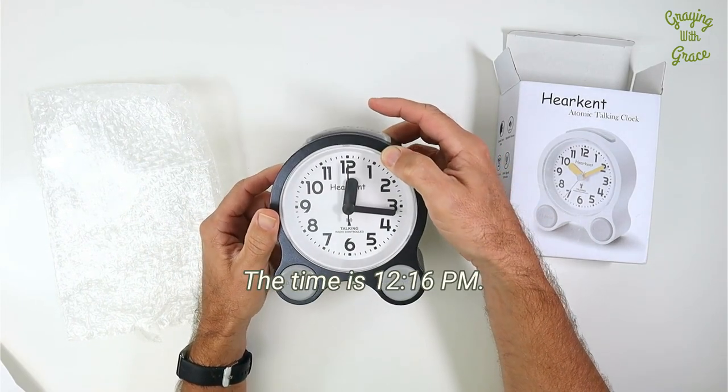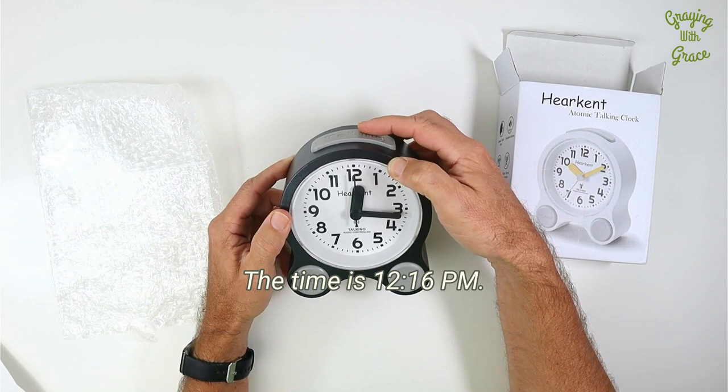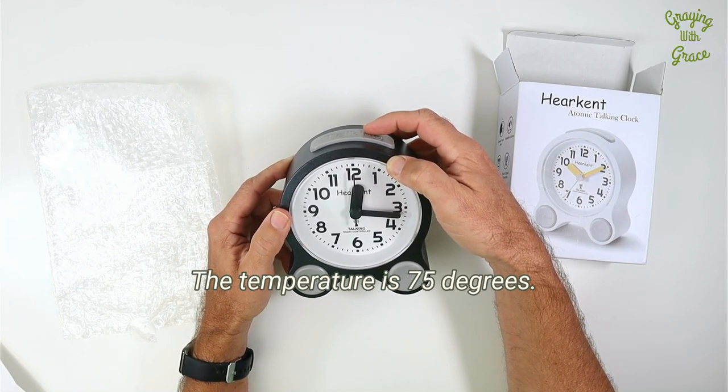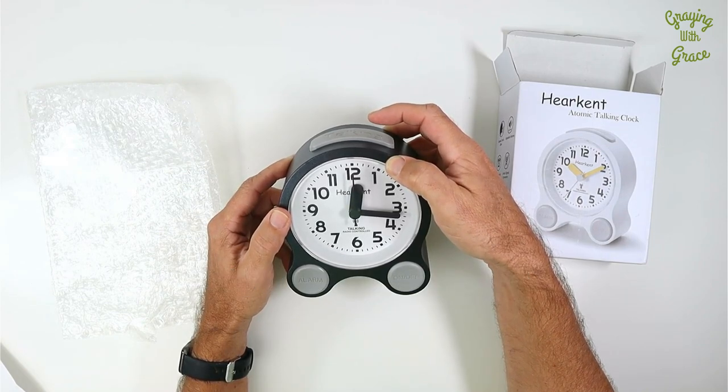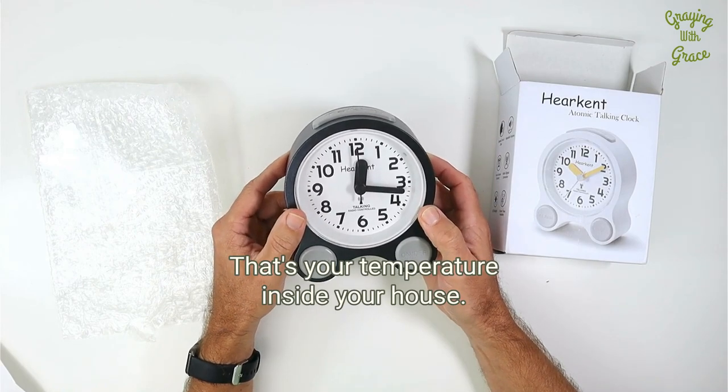The time is 12:16 p.m. The temperature is 75 degrees. Today is Saturday, January 1st. That's your temperature inside your house.